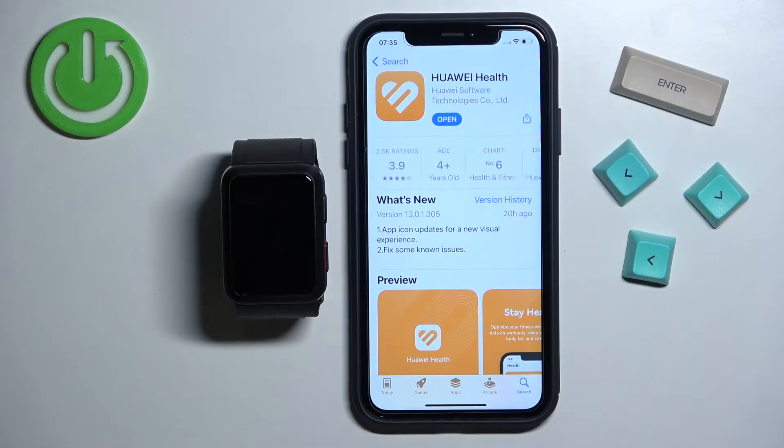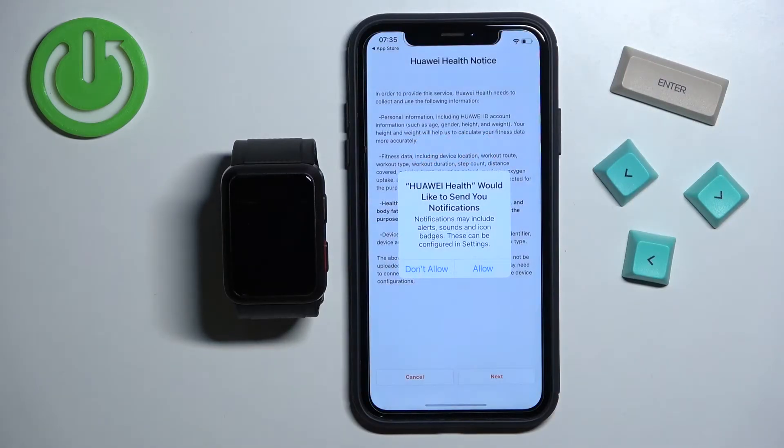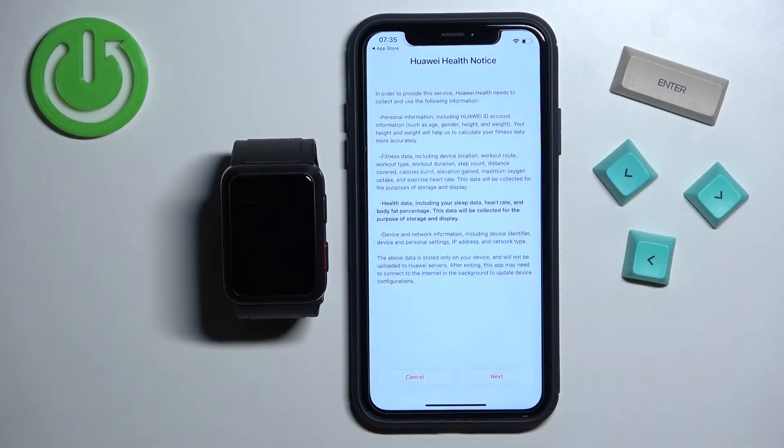Once the application is done installing you can tap on the Open button to open it, or you can open it by tapping on the icon of the app. Now we can allow or deny permission for notifications. Basically if you want to receive notifications from your iPhone on the watch you need to allow this permission. If you don't care you can deny it — I'm going to allow it.